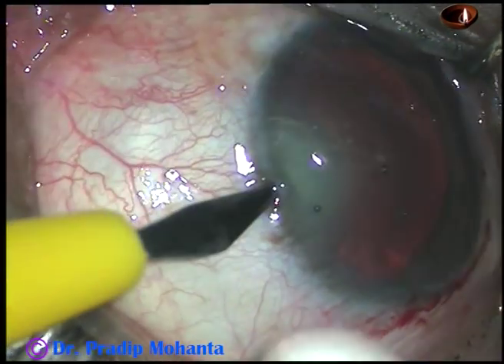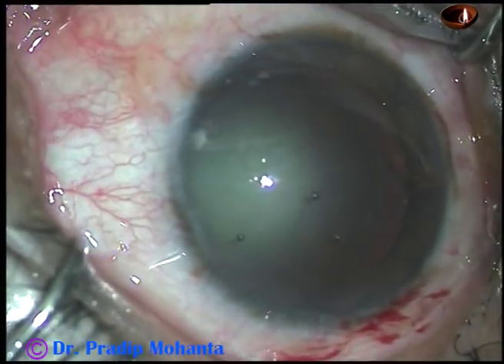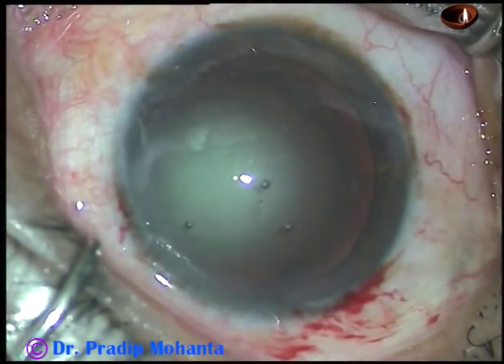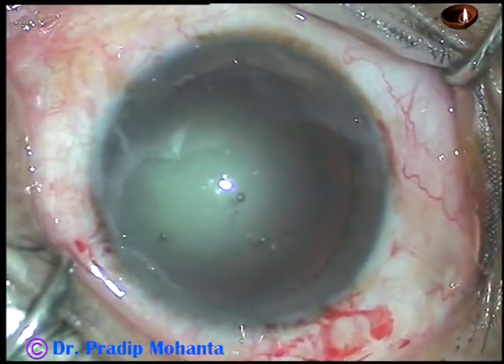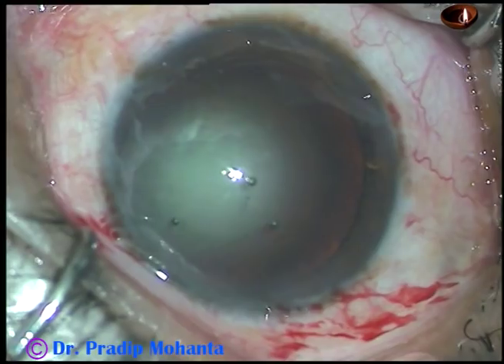These stab incisions are about 3 clock hours away from the main incision. So whatever astigmatism that has been induced by the main incision gets neutralized by these sideports.